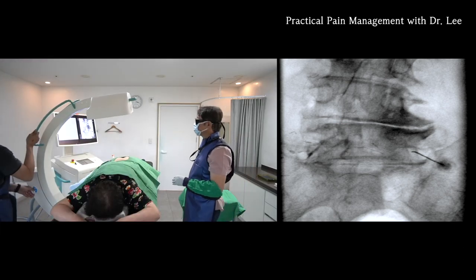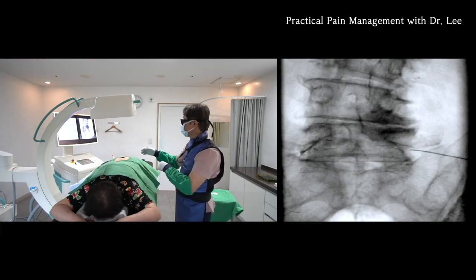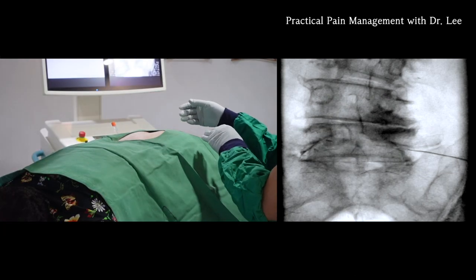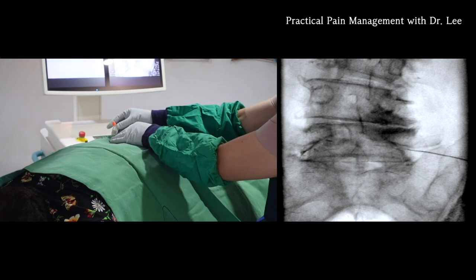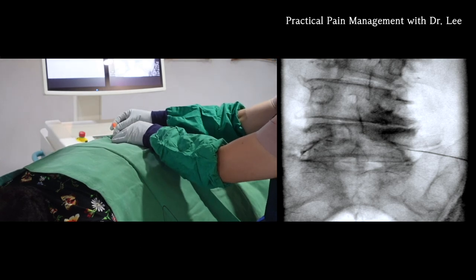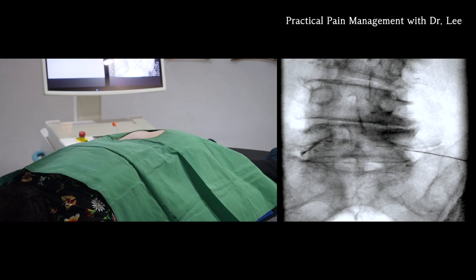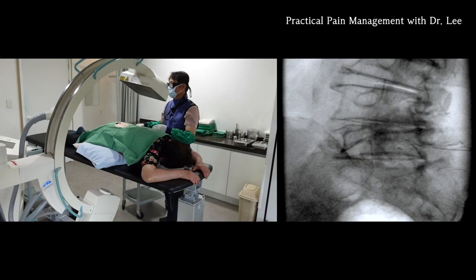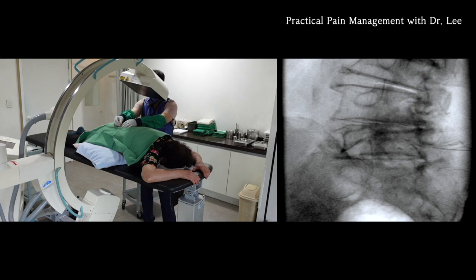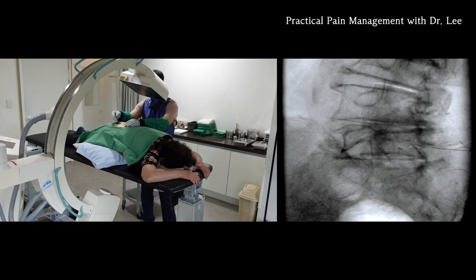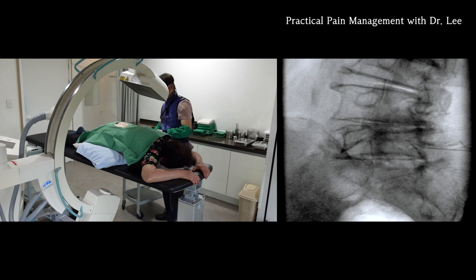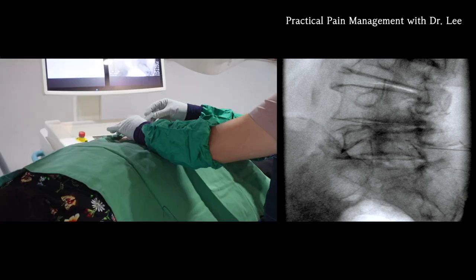Let me show an AP view. Now let me show you the contralateral oblique view. I think the contralateral oblique view provides better needle orientation and saves time with the reduction of scattered radiation compared to the lateral view.